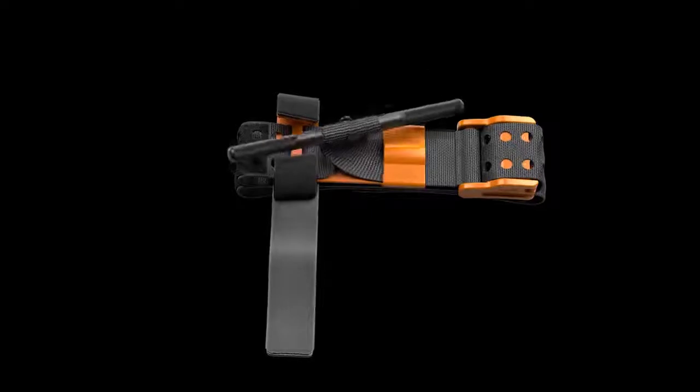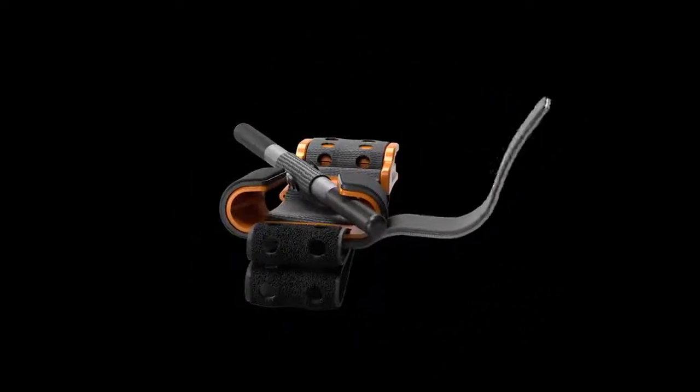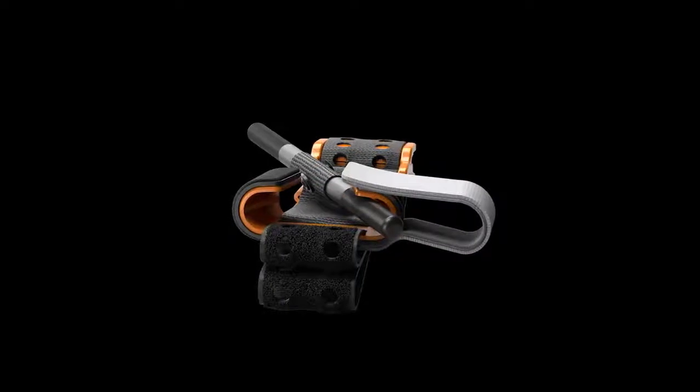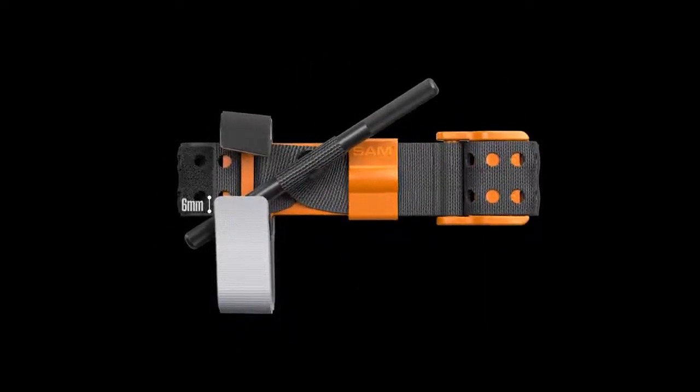Place the metal windlass rod back into the windlass C-hooks. Lastly, affix the grey time band back onto the windlass C-hook Velcro with one-quarter inch or six millimeters extending beyond the C-hook edge.